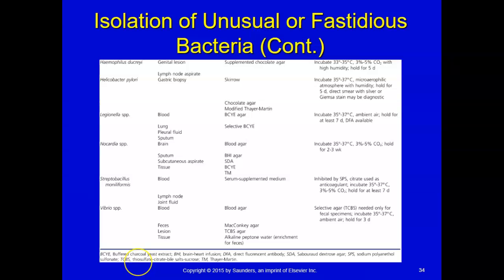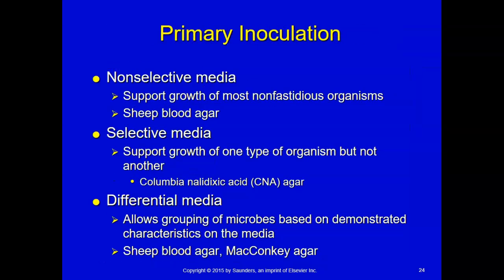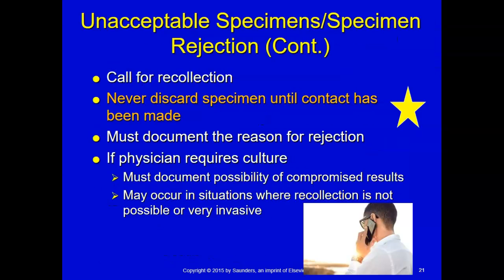I forgot to add one thing on rejected specimens. So what do you do if a physician just really insists that you go ahead and do a culture? Even if you try to reject it and you explain to him this has been sitting out for 3 days or 2 days, or this wasn't labeled, and he just throws a fit, you can go ahead and plate it and set it up and add a comment explaining that there would be a potential contaminant.